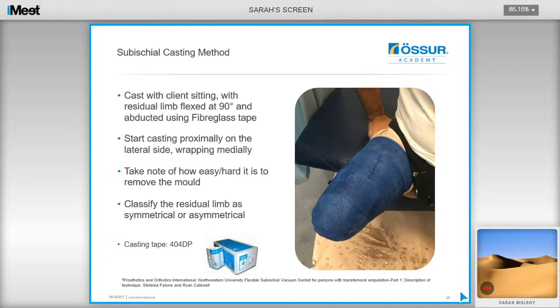The impression is taken with the patient sitting in a chair, with the buttock of the amputated limb at the edge of the seat and the residual limb off the chair, flexed at 90 degrees and slightly abducted. This allows gravity to pre-modify the limb shape, creating a slight rectus relief, a generous medial flare, and a narrow ML due to posterior soft tissue droop. Slight abduction allows the cast to be taken as proximal as possible. It is recommended to use casting tape, capturing a cylindrical shape with no manipulation of soft tissue. When removing the mould, note how easy or hard it is, as this will influence modification. Also assess whether the residual limb is symmetrical or asymmetrical.